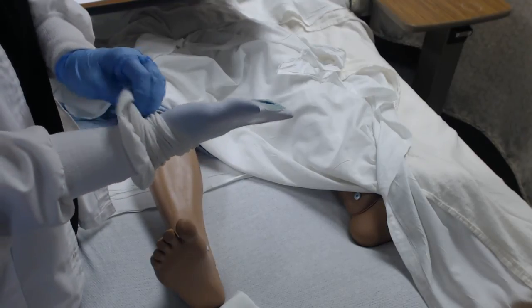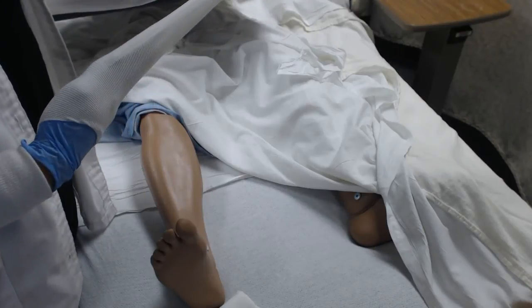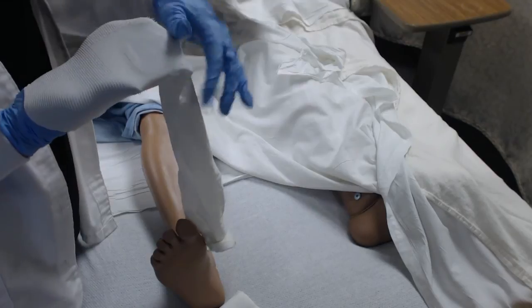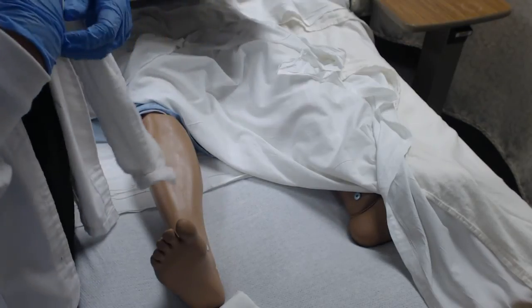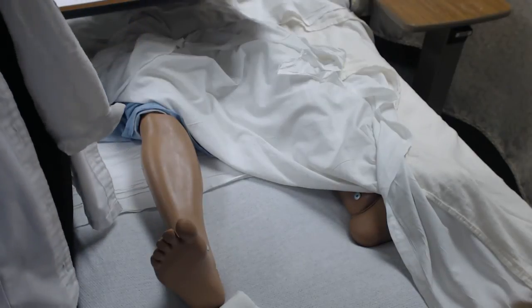And then you're going to undo it. So you're going backwards now, keeping in mind where that hole is. It's right here. That's going to help me. So now I'm going to take it off my hand here, and that's going to help me put it on the patient.